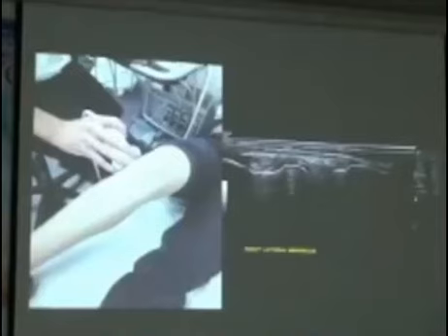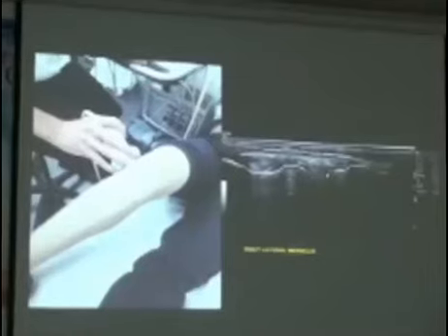So to examine the lateral compartment, once again, patient just laying on their back with their knee bent. And you can see here the normal appearance of the lateral meniscus, this triangular echogenic shaped structure. And then we have the collateral ligament sitting over the top of that.